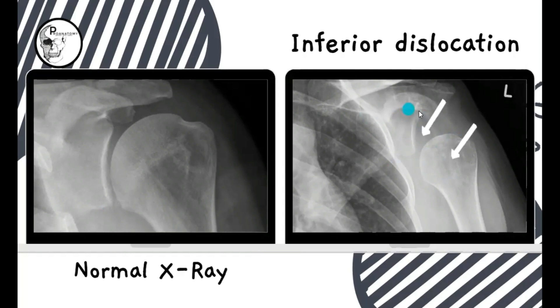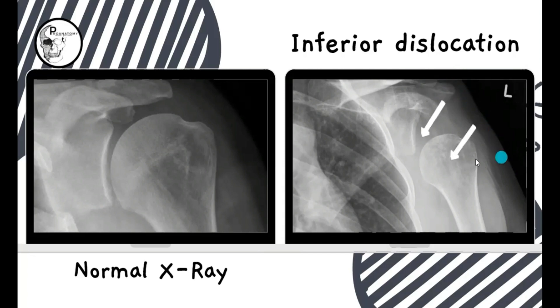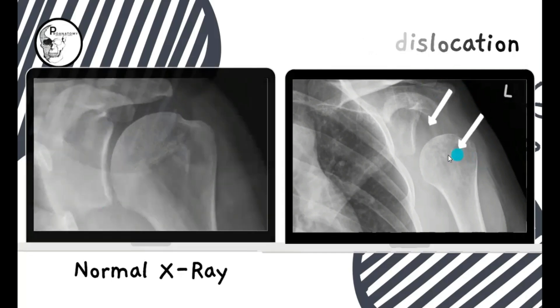Here you can see the glenoid cavity and the head of the humerus being separated, with a noticeable increase in joint space. Even the soft tissue outline has been flattened out below the acromion process. These are the typical signs of inferior dislocation of the shoulder joint.